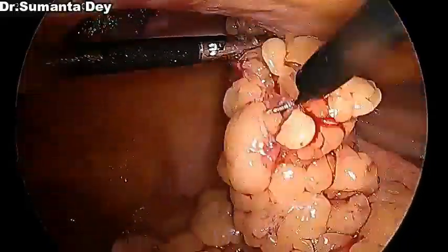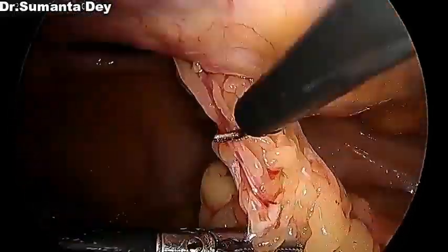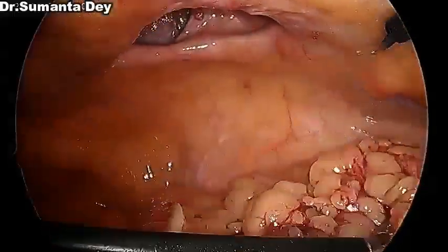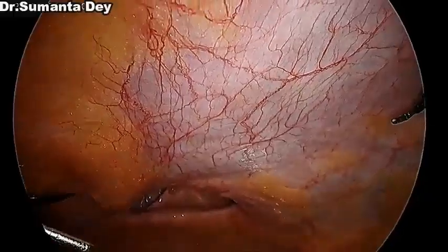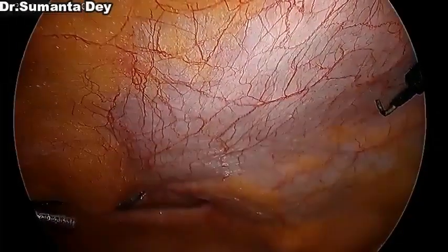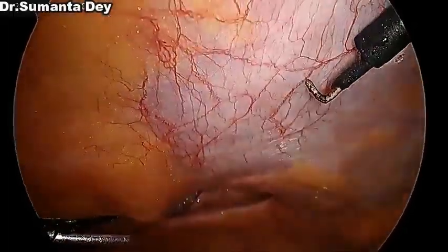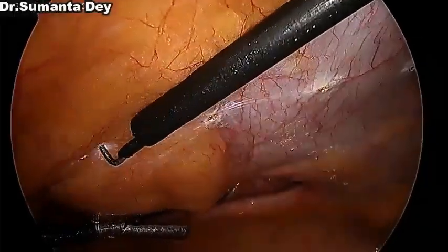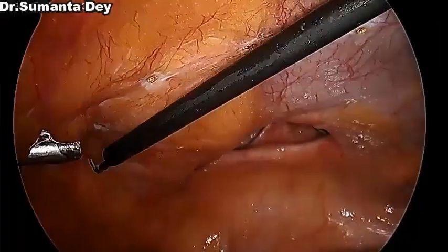So I just, with a good amount of traction and counter traction, am trying to reduce all the fatty content and omentum content out of the hernial sac. After reducing, just confirming my finding of the hernial defect size, you can see it's over the right iliac fossa, around 5 cm by 4 cm defect. And now from the proximal border of the defect, I am just scoring the peritoneum with the monopolar hook, from where I will be lifting off the peritoneum.